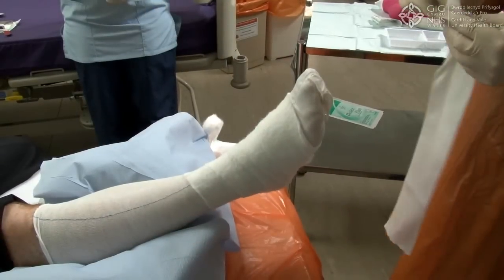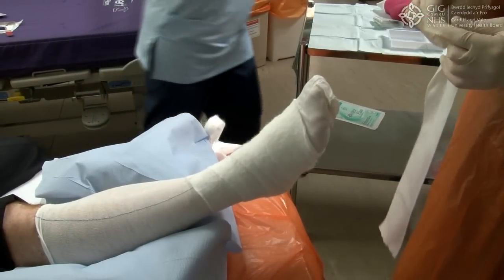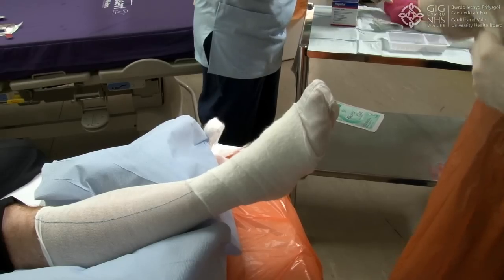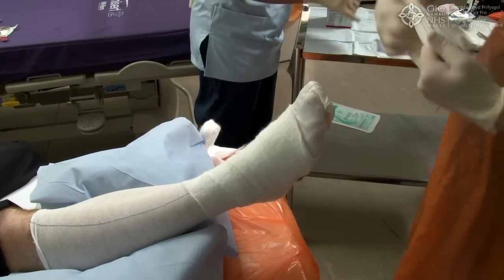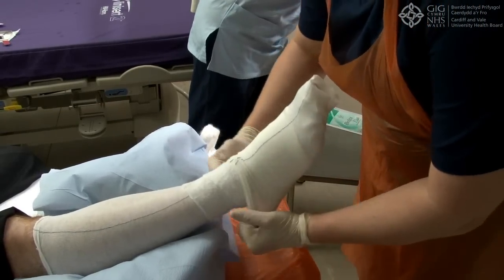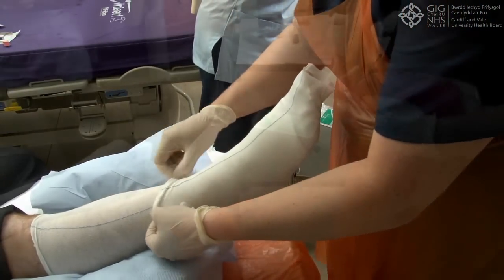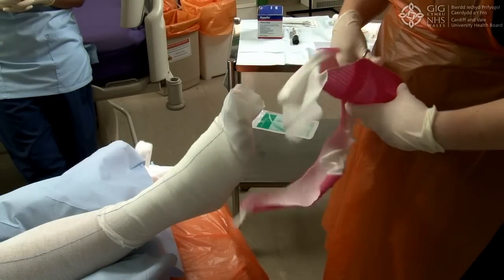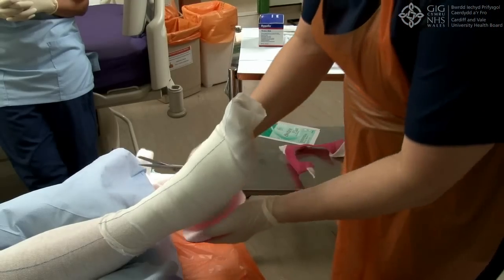Check to see if the FLEX wool and initial layer of blue or yellow line Tubifast are dry. If damp, remove and reapply. Apply a new layer of blue or yellow line Tubifast over the FLEX wool. Cut the cast into a heel cup shape so that it fits just around the ankle bones.